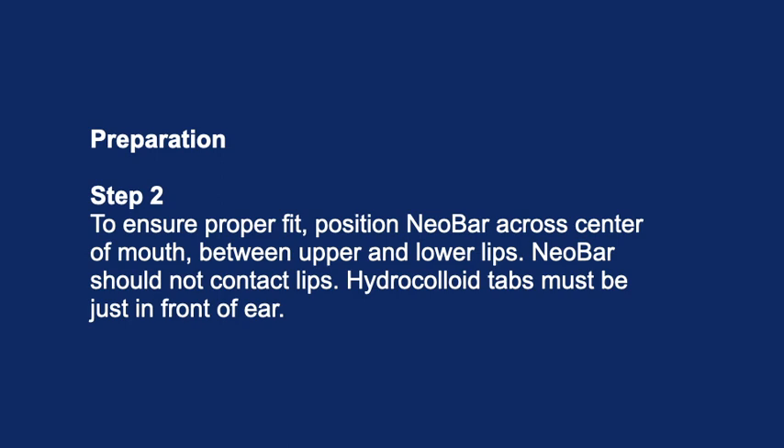Preparation step 2: To ensure proper fit, position the NeoBar across the center of the mouth between the upper and lower lips. The NeoBar should not contact the lips. The hydrocolloid tabs must be just in front of the ear.